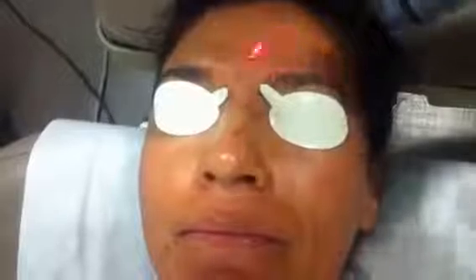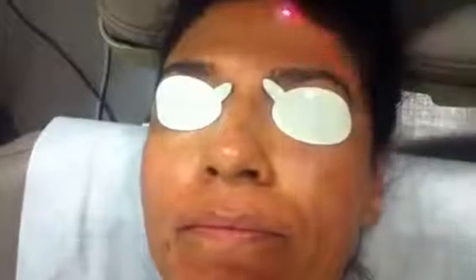We're going to have the patient look straight ahead. Now we're just doing the subsequent passes. As you can notice, it's not quite as loud, not as much noise, not so much of that yellow light being shown, because now we're really just going after the inherent pigment if there's any sort of pigmentary disorder. This patient before treatment had quite a few brown patches on the forehead and on the cheeks — on the left side of the cheek there was a big patch. She had gotten burned from an IPL and that has really resolved. It's about 95% clear at this point. She looks really great, and we've been maintaining her for quite some time. It's just a nice, quick, easy treatment — takes about 10 minutes to do.